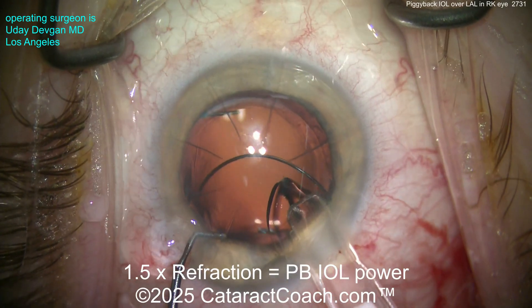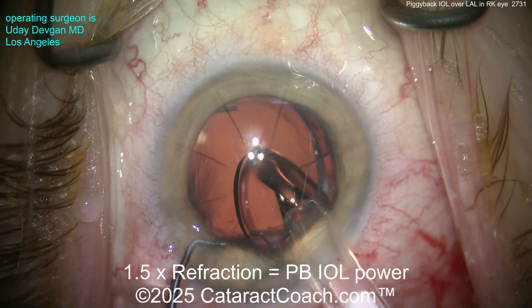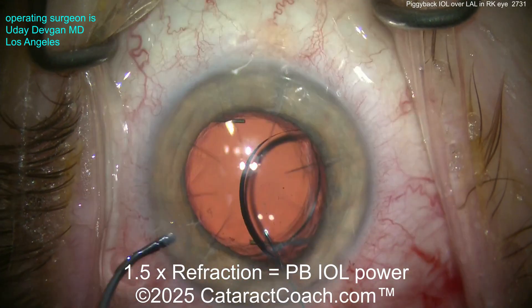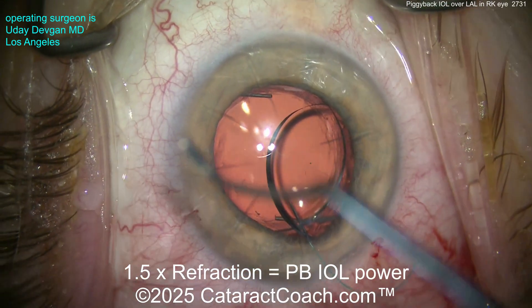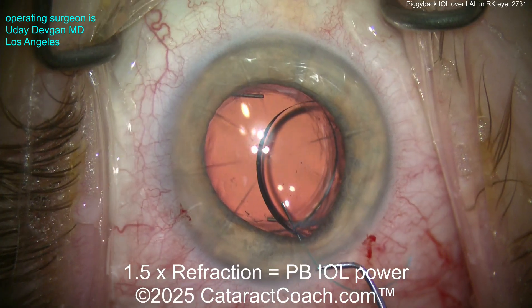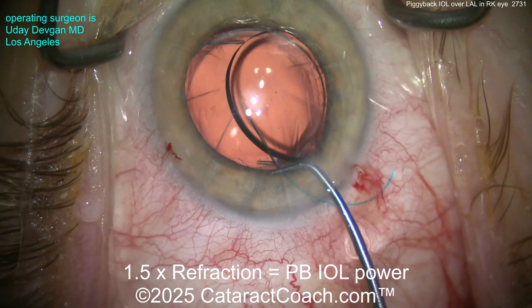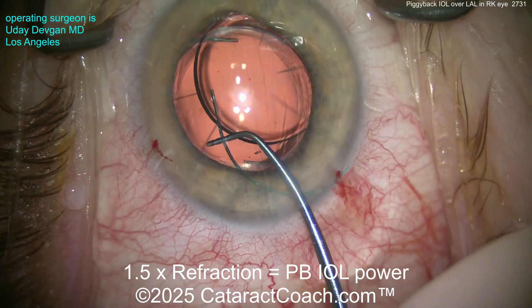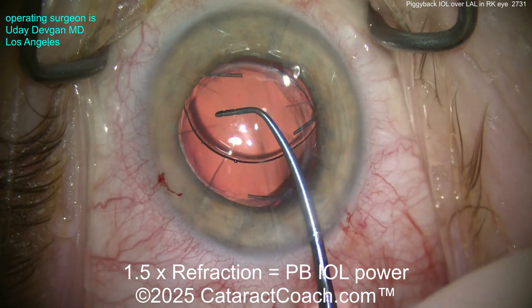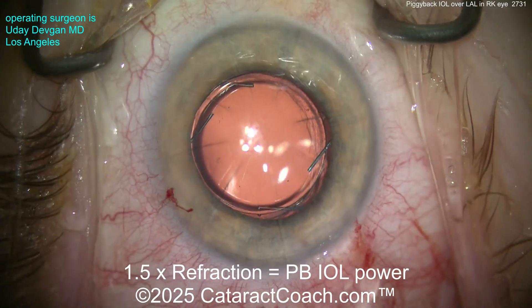Here you can see we're inserting an IOL going into the sulcus — here's the piggyback lens going right in. Now in an RK eye, you really can't do any more LASIK or PRK. You probably don't want to do an IOL exchange, especially if the lens in the bag was adjusted for cylinder power as well. You've got to just do a piggyback lens — that's your best move here.